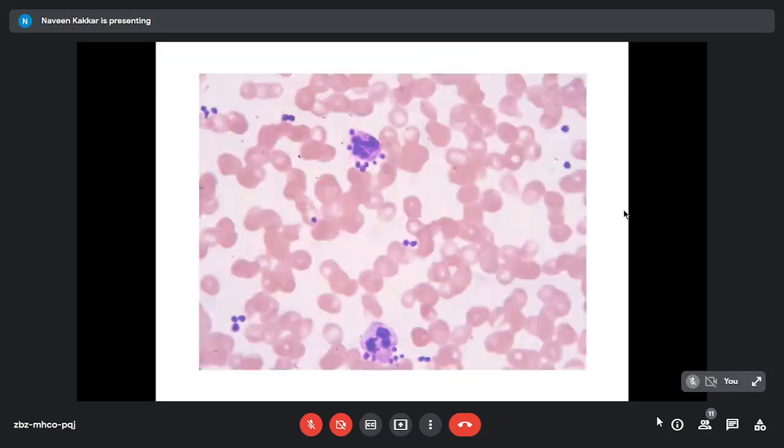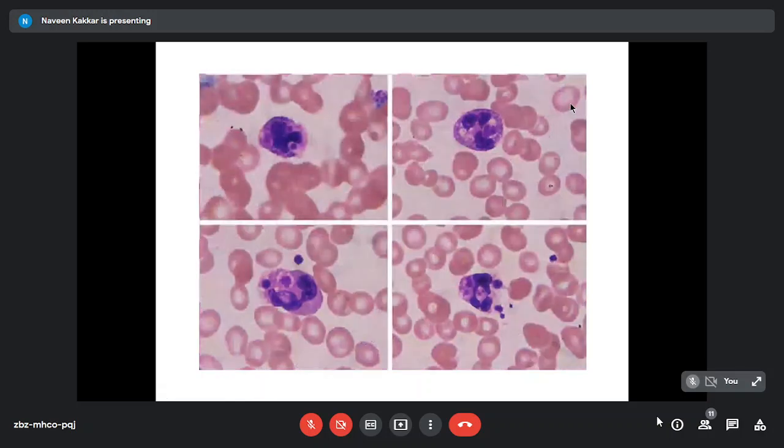What did the smear show? Two or three things here actually. Small platelet clumps there, not very big, but platelet satellitism consistently. Here also platelet satellitism and there. And one more phenomenon which is extremely rare is platelet phagocytosis. Some of the neutrophils here show engulfment of platelets. There's one big one there, small one, 3 here, 2 here, and maybe 2 here.